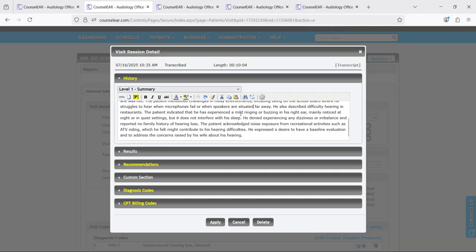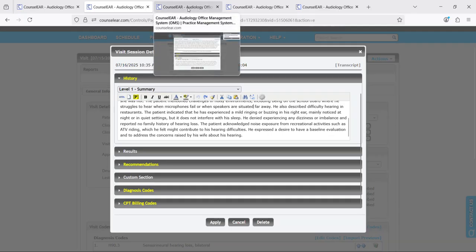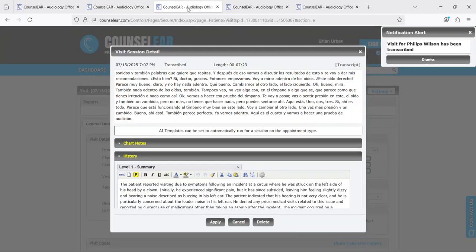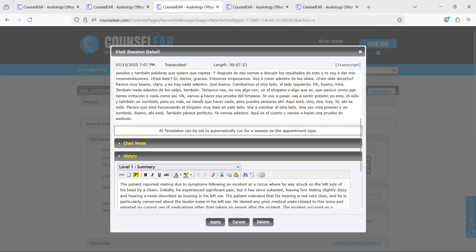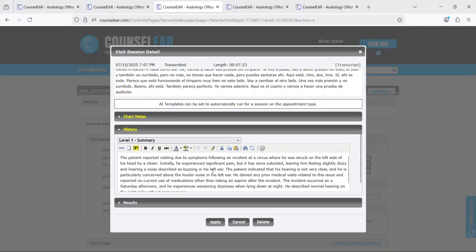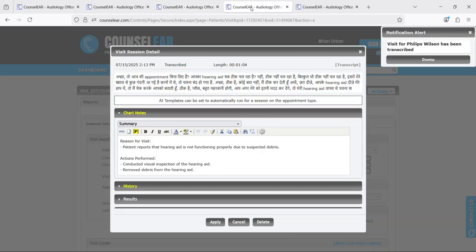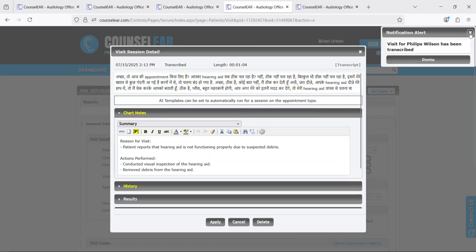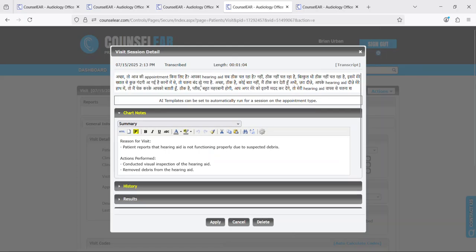Now it's important to note that this system is also multilingual. So it gives you the ability to record sessions, to have sessions in different languages and have it then render the results in English. So here's an example where the session was in Spanish and then the AI generated text is in English.